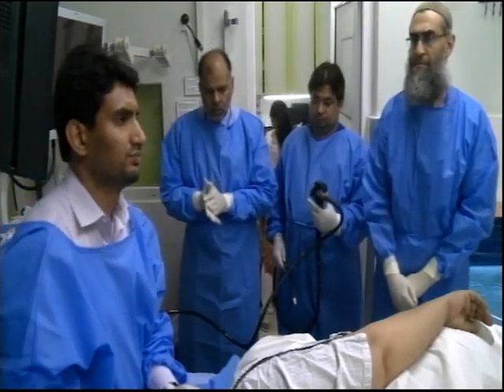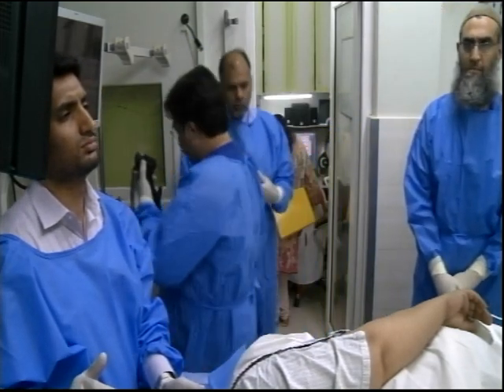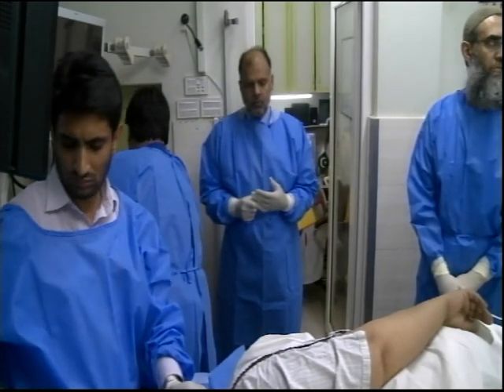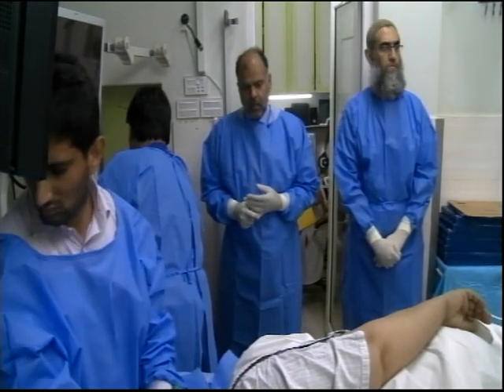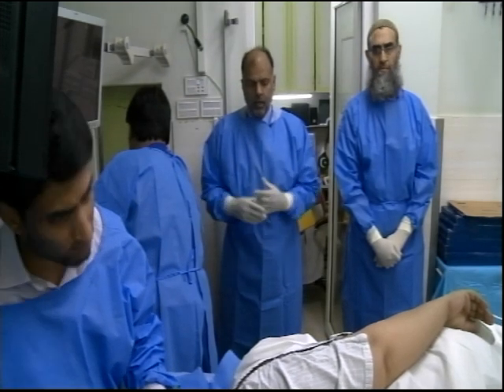So submucosal lesions are usually evaluated, number one, as you said, you have to start from the history. So the age of the patient will tell you what type of lesion you expect. Endoscopic appearance might also tell you what type of lesion we expect, and certain mucosal characteristics, and then of course the characteristic of the lesion.